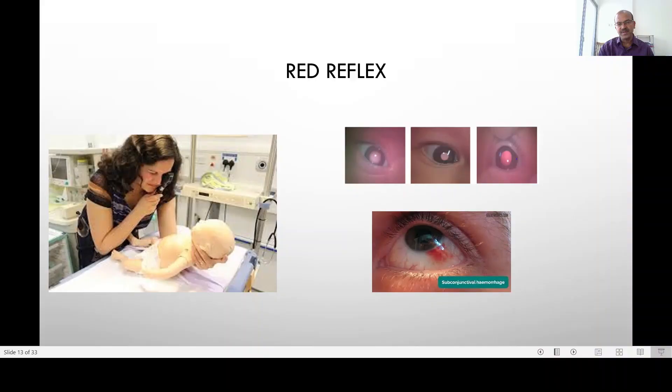Red reflex is a very important part of the assessment and many of us may not be doing it routinely. If you are not doing it routinely, please start incorporating it. It only needs an ophthalmoscope and it's fairly simple to learn.